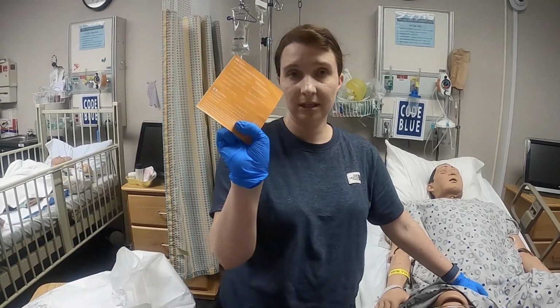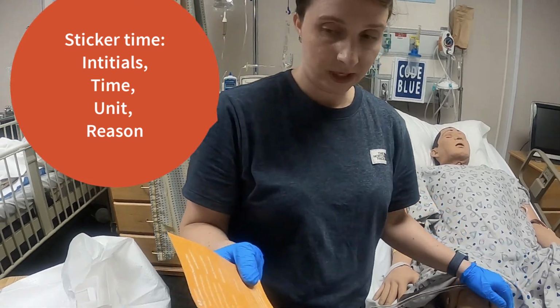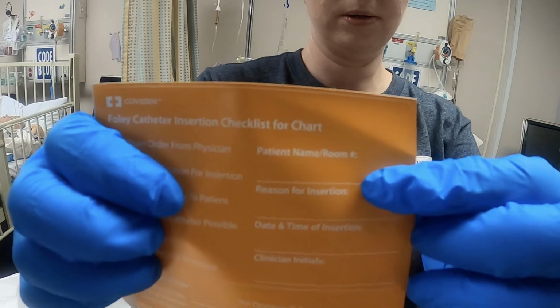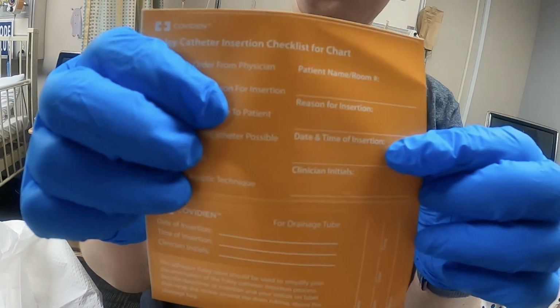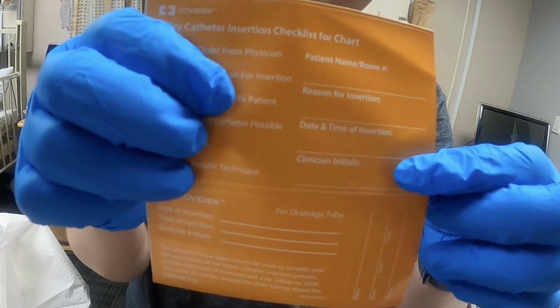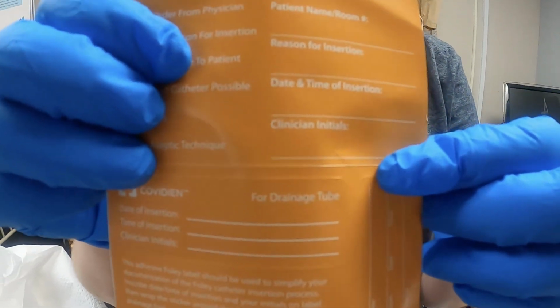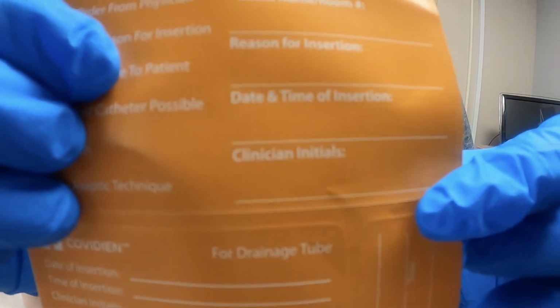Don't forget to attach your sticker that we had sitting right here. Again, your room number or patient's initials, the reason why we inserted it, date and time, as well as your initials. Why? That way everybody knows exactly when and why the Foley catheter was inserted.